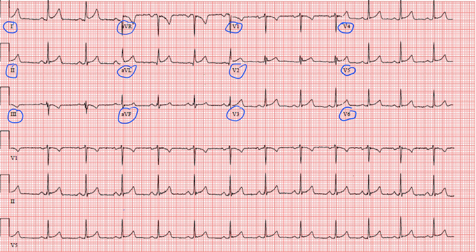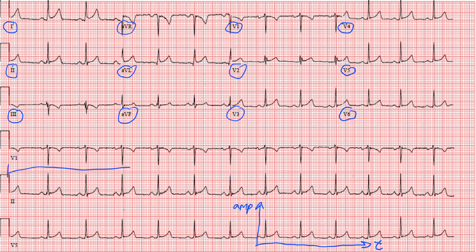When looking at a 12-lead EKG, it's easiest to think of the x-axis — so horizontally — as a measure of time. And vertically, this is a measure of amplitude. A typical 12-lead EKG records over 10 seconds, so from the start to the very end is 10 seconds.